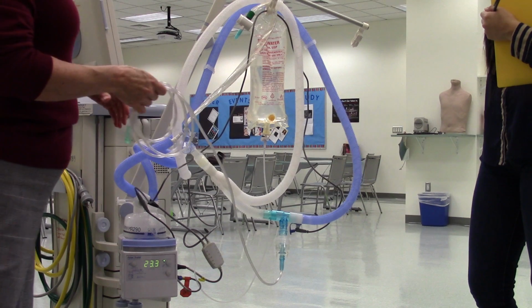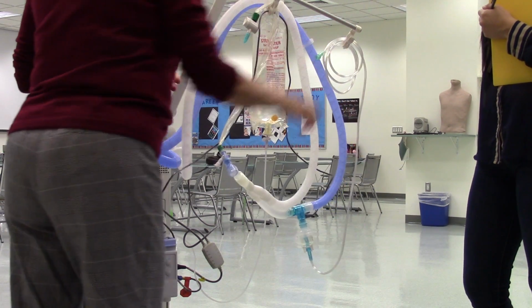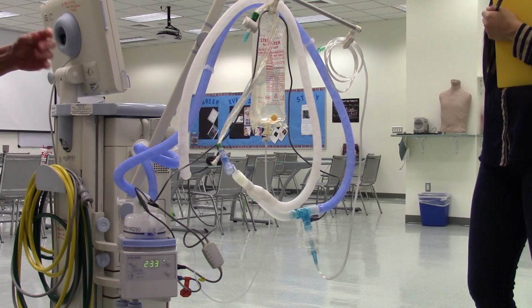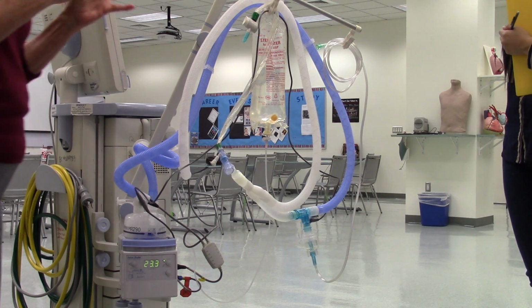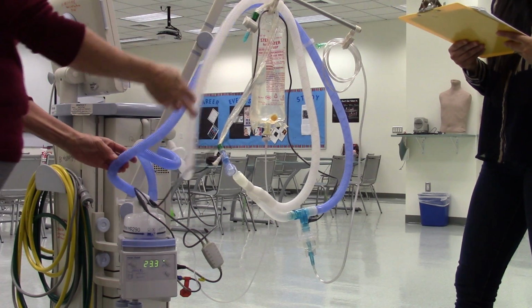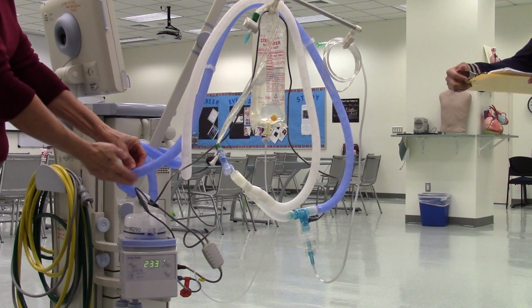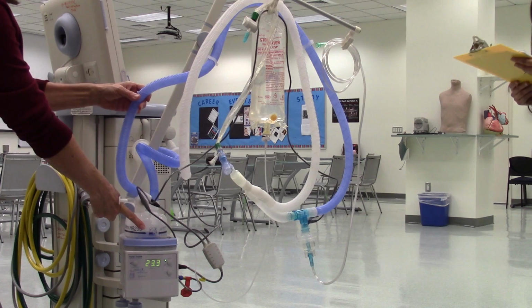It says, answer the following questions. Is it okay to drain condensate back into the chamber if some water collects in the inspiratory side of the tubing? No. Well, actually, the answer is yes. Do you remember what I was telling you about water vapor? Water vapor comes out of here and it can't carry bacteria to the patient. So like the way the tubing is right now, you'll get some condensate after a few hours, and if you lift this up and let it drain back into the humidifier.